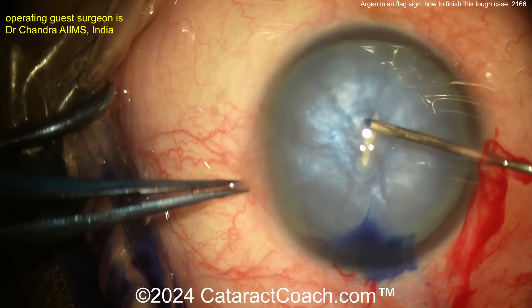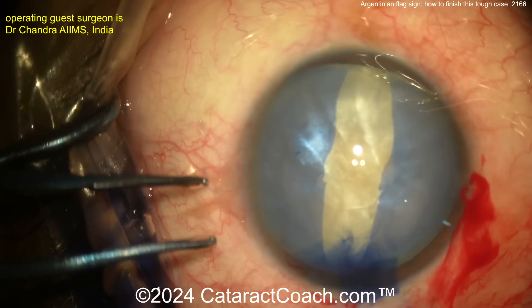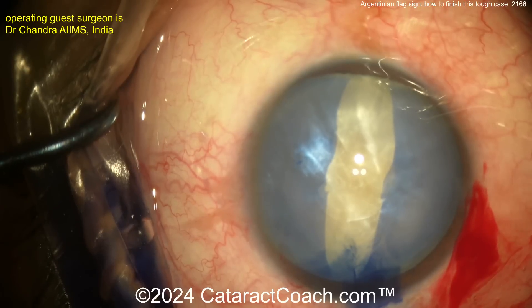Eye full of viscoelastic, trypan blue dye, trying to get a rhexis started and zip it right out to the absolute equator, both sides. Now what? We all know why this happened because the bag was pressurized.